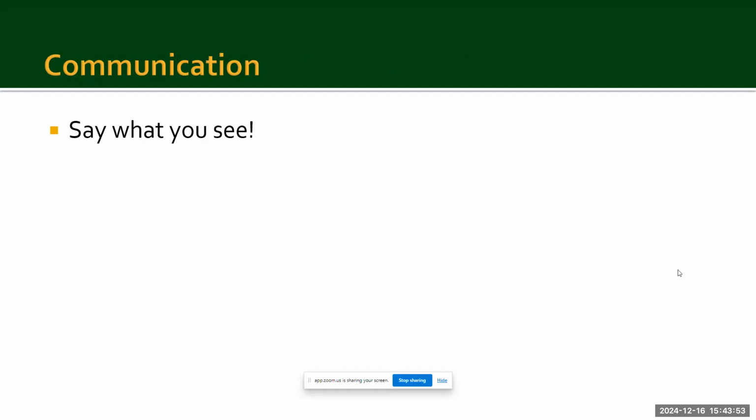So, this is what I say to everyone, including my trainees: say what you see. Nothing more, nothing less. Imaging can guide you, clinical history can, of course, guide you, but you're a pathologist, so you say what you see. If it is a very scant sample, if there are rare cells, I tell them, hey, these are very rare cells, but I see the patient has a history of such and such. I won't be able to tell you if this is epithelial versus mesenchymal versus lymphoid. I need a better sample.